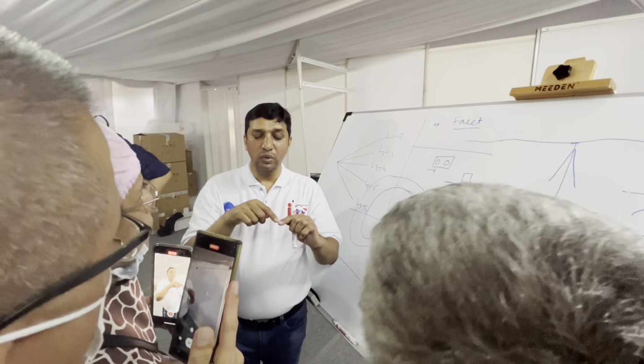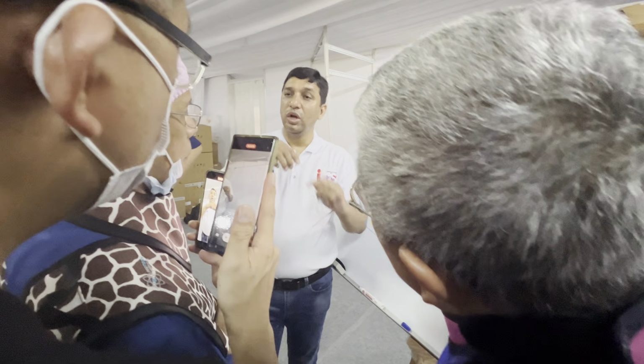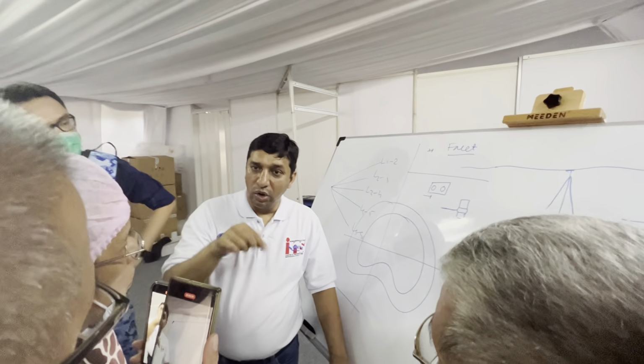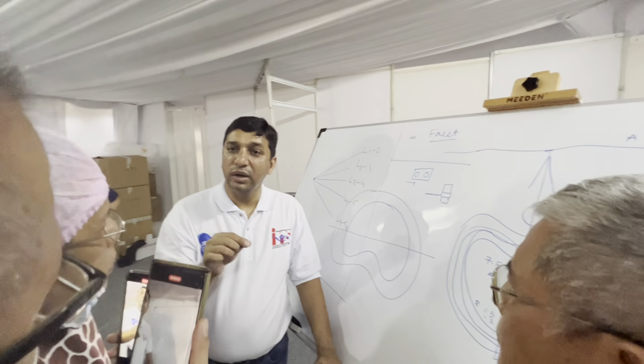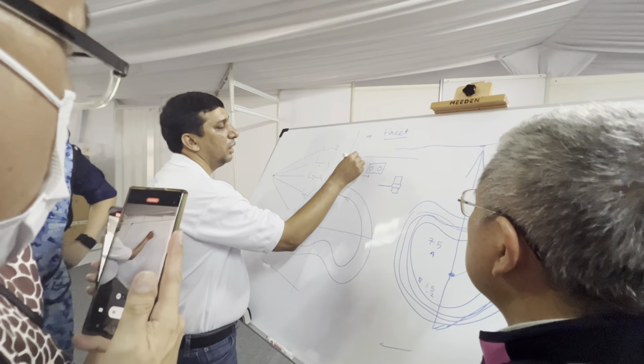Then you take the needle out a little and go inside. Now you are going to the foramen. So you see, okay, I'm going fully. Then you have the annulus. So the second step is the annulus.